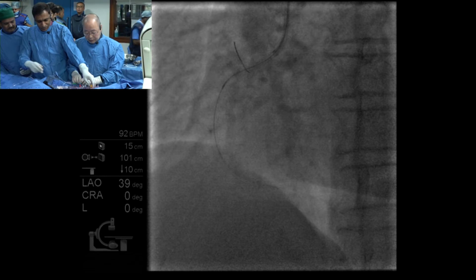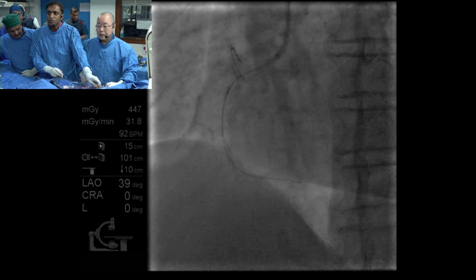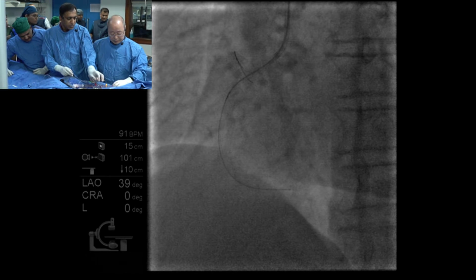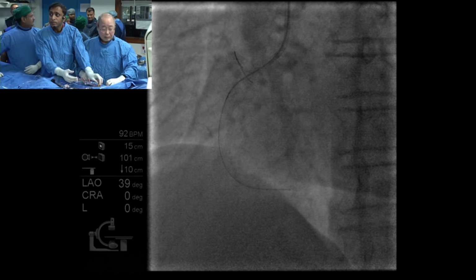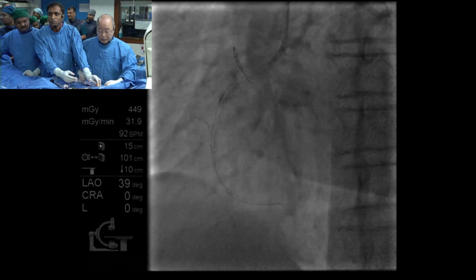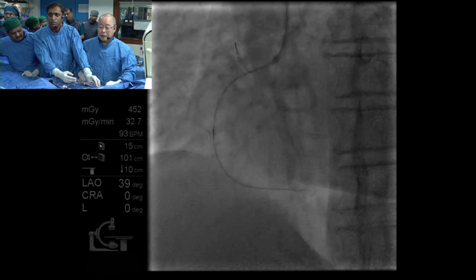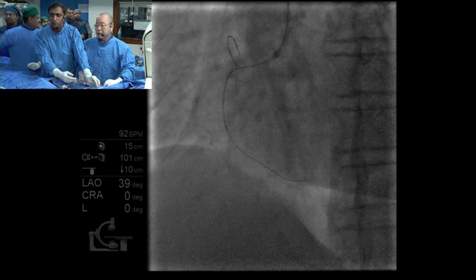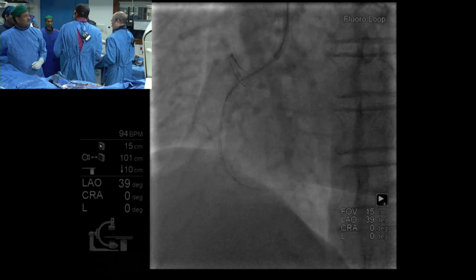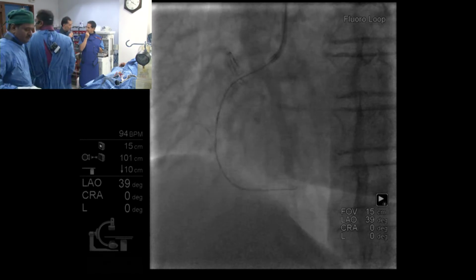Okay. So I try to cross this Caravel microcatheter through the region. Dr. Saito, your experience of the Caravel in calcified lesions? We've had some reports of the tip coming off. Fragile, yes. So you don't twist the Caravel, you just push it through. Yes, the tip is very important. I just asked you before the case, you said you can twist a little bit. Okay, so can I have a regular wire? A lot of people still twist the Caravel a little bit, but not too much.